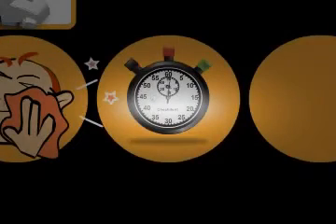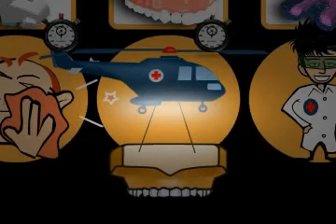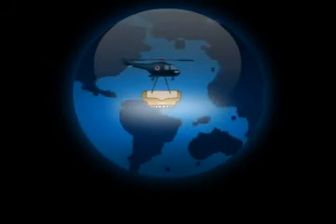However, correct mixing and usage of appropriate materials is not the only thing that's important. Packaging and transportation of the impression is just as important, as is the amount of time the impression spends in the patient's mouth. All of these steps should be carried out in accordance with the manufacturer's specifications in order to avoid any deformations. Long transportation times to the technician, for example to a technician in China, will rarely result in quality work.